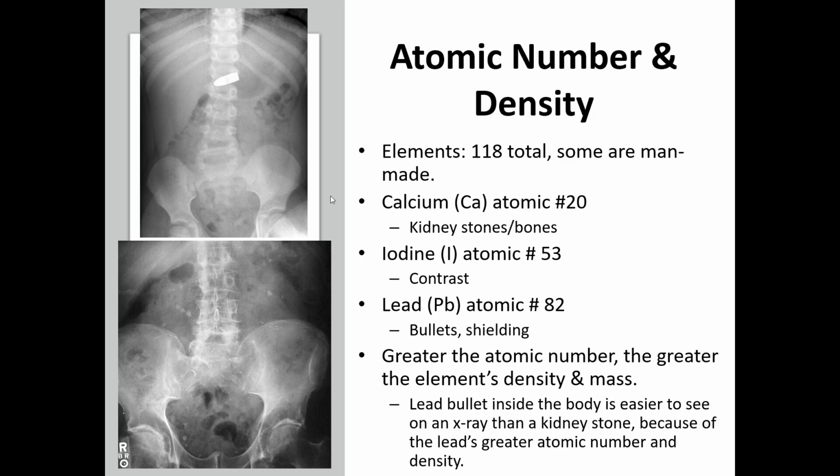So calcium, which makes up kidney stones, as you can see in these pictures, kind of all over the place, some down in the bladder. A couple of these might even be in vasculature down in the common iliac arteries and veins. And then bones as well, kind of make up the pelvis here. This is a child's pelvis. You can kind of see the growth plates. This is an adult pelvis. There's no growth plates, solidly formed bone. Not a very healthy looking spine in this area.